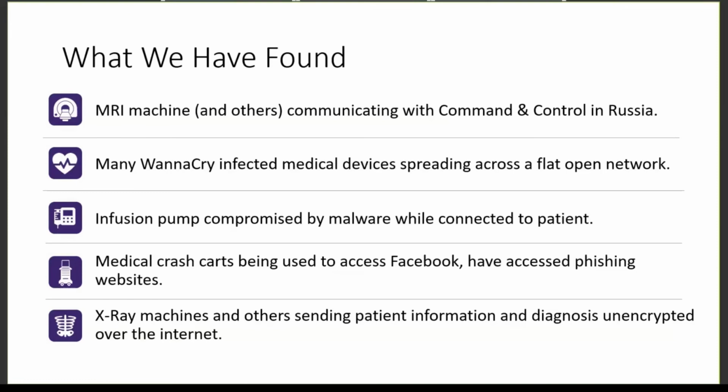We've seen many WannaCry infected medical devices spreading across a flat open network. Many of these devices that have been affected by WannaCry are actually Windows devices. As we spoke to in many cases in this session, a lot of these devices are hard to patch. You patch them, they need to be recertified by the FDA. The patch may be problematic for a number of different reasons, and you may not be able to apply it effectively.